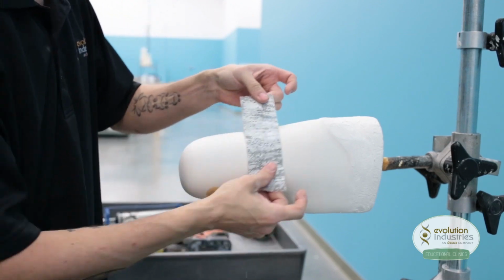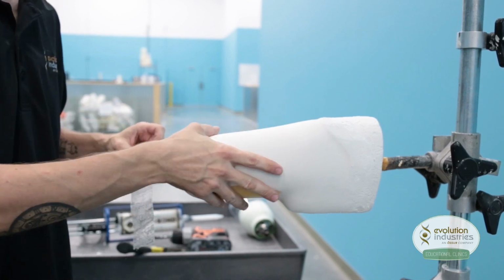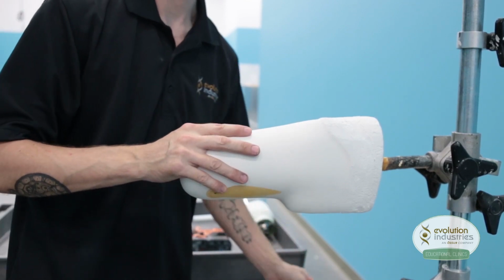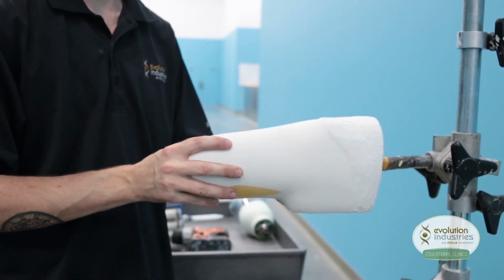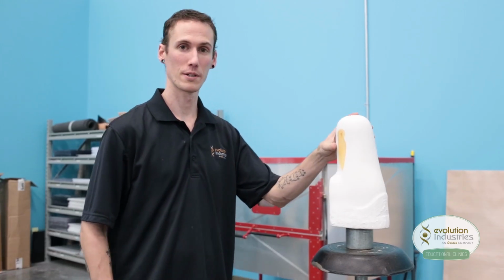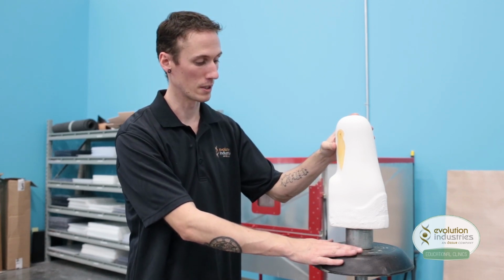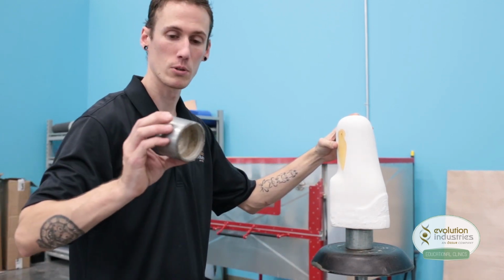And then you just want to smooth your cast up so you have a nice clean surface. And then we will go over to the vacuum jig and pull our 1/8 inch PETG. Once you have your cast clean and smooth, we're over at the vacuum jig. You want to elevate it off your vacuum plate. We use a 2-inch metal collar.